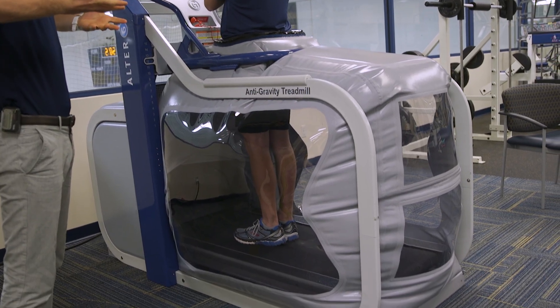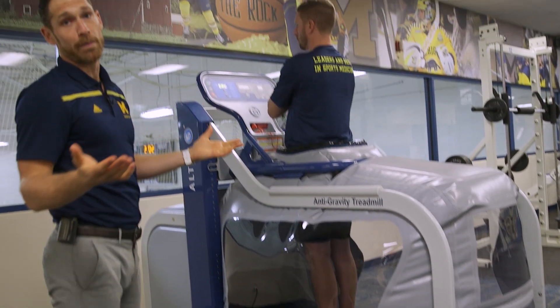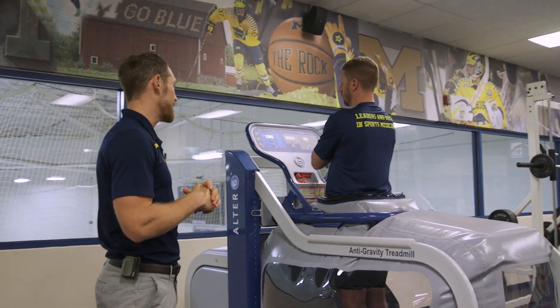They will feel like they're getting elevated and lifted up some during this, and then once it's calibrated it'll take them back to full body weight, basically a normal stance at that point.